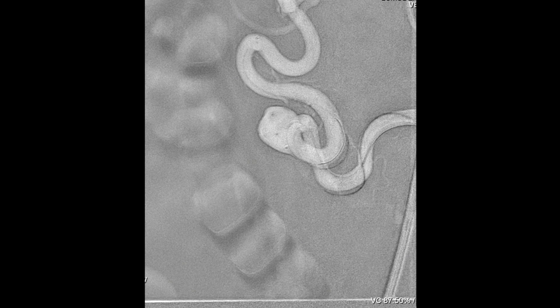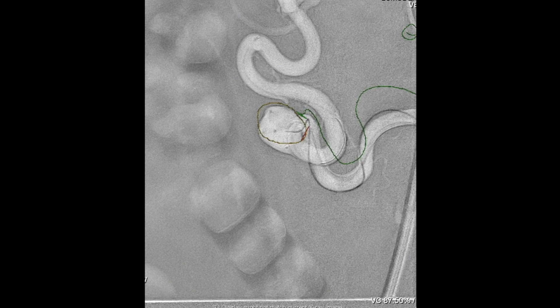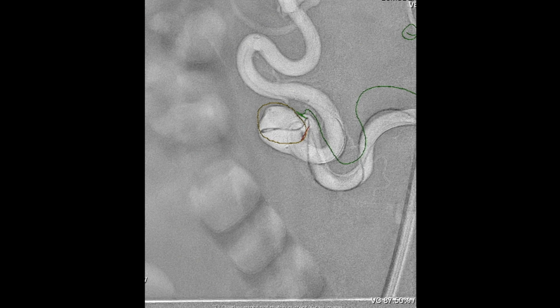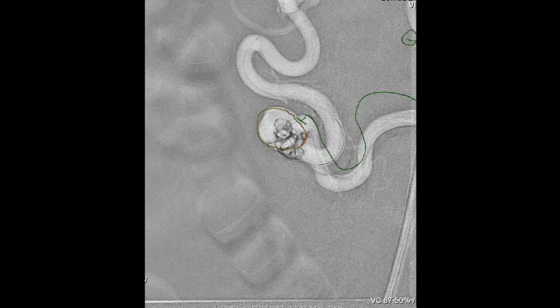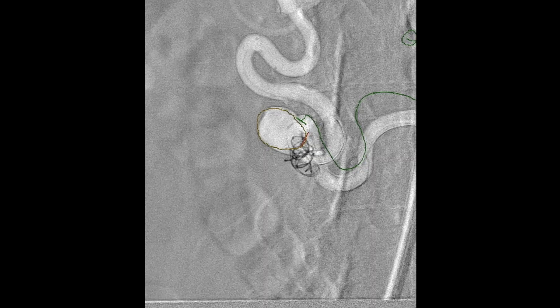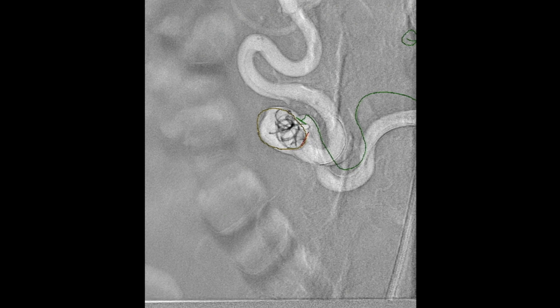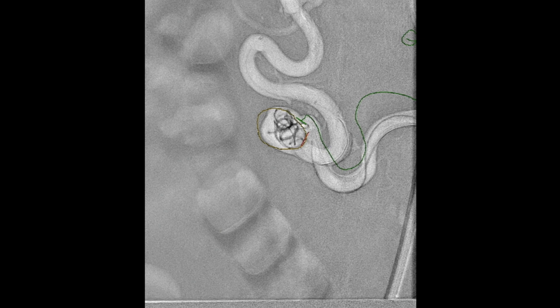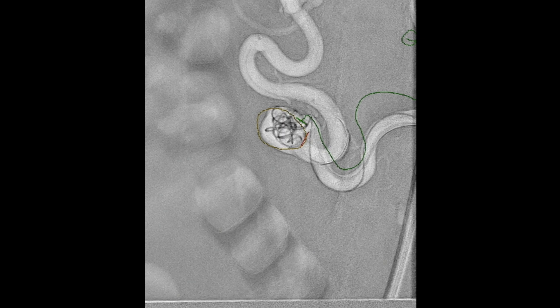You can see it's a fairly large artery. Once we got these two wires in position, we started packing inside the aneurysm with a coil. You can see how much respiratory motion there actually is. We frequently used road mapping to subtract out the previously placed coils, because once you start packing it becomes difficult to see where the new coils are actually going.